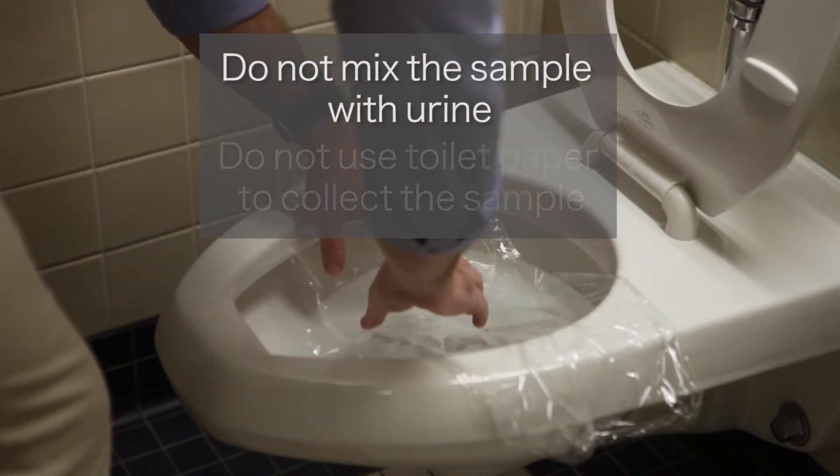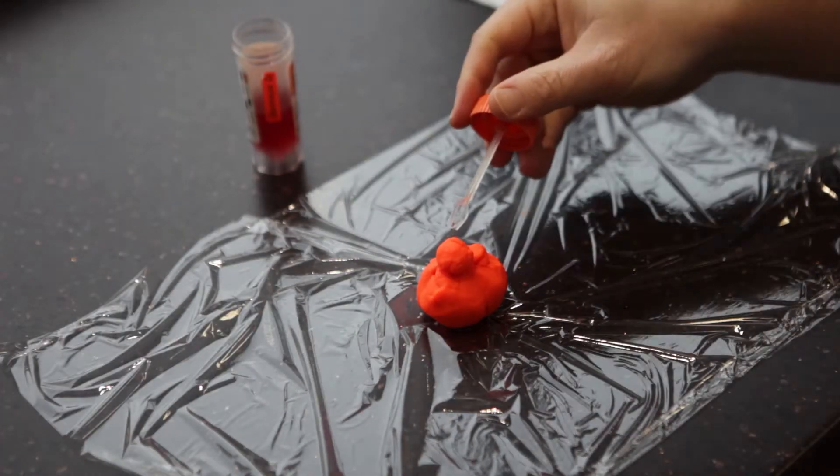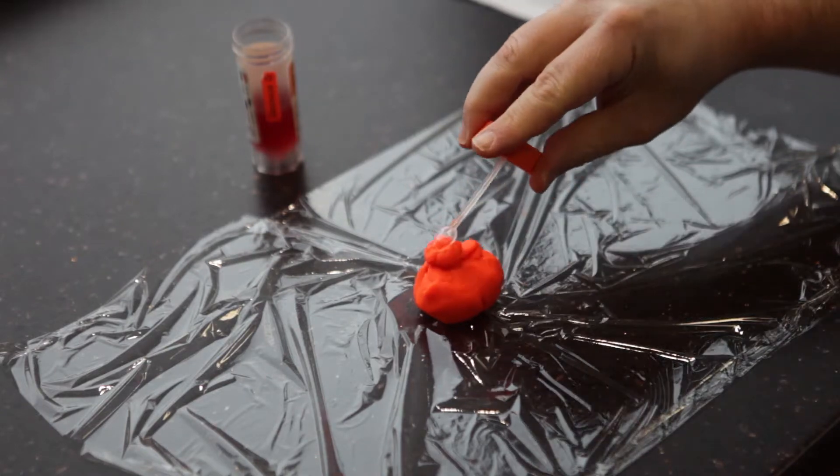Don't mix the sample with urine or use toilet paper to collect it. Use the spork attached to the vial cap to transfer about a teaspoon of stool to the vial. That's about the size of a marble.